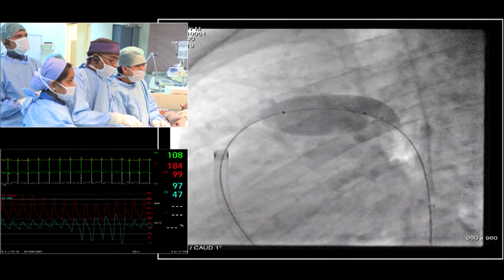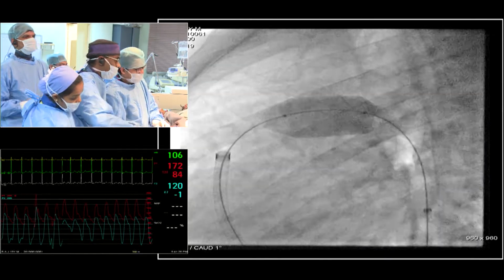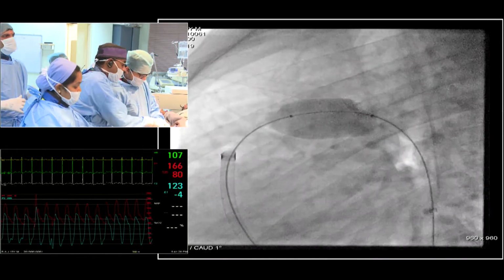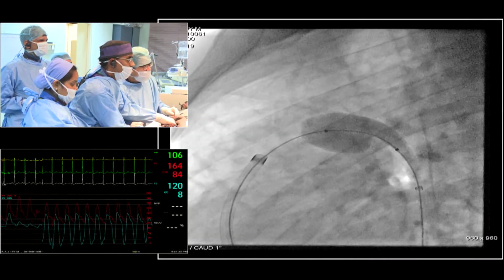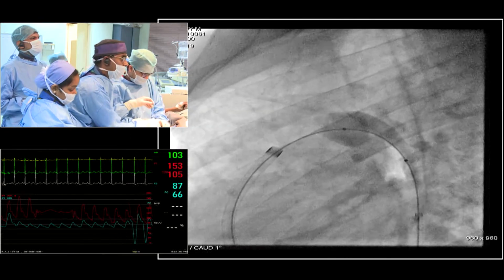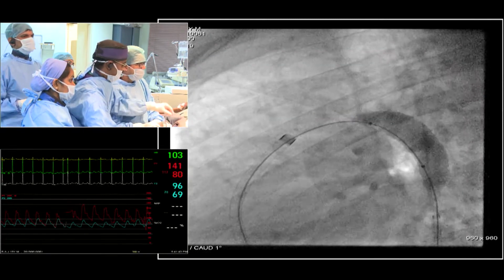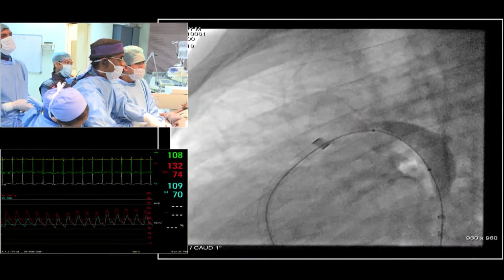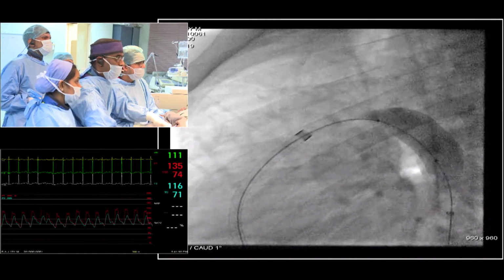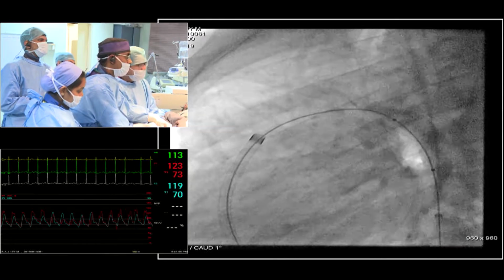Okay. Apologies. So, Deepa, how about you? Tell us what cutoffs, because Shiva, you have measured the duct now. You can use a device, and I would use a ventricular septal device with a coronary stent delivered together, and then you have reduced the duct, but you still have an option in case you need reverse Potts shunt physiology. But you cannot leave the duct at such a huge size. I guess that would be an option.